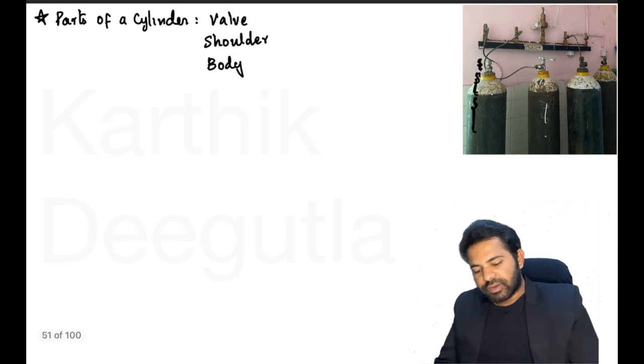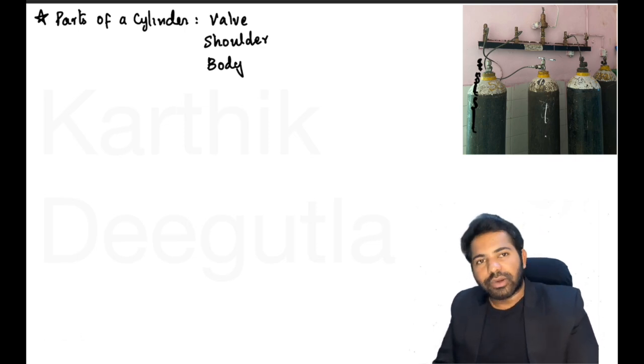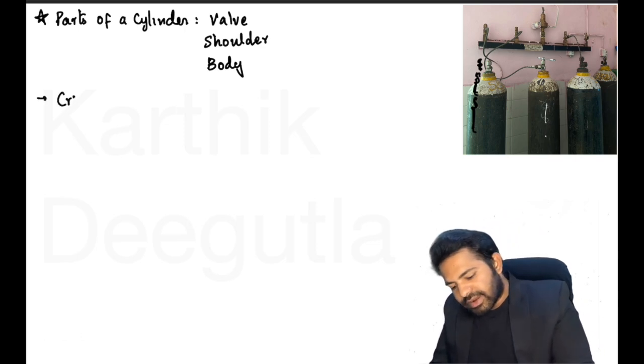Now before we go into the detail of the color coding of the cylinder, let us know what is known as the critical temperature.